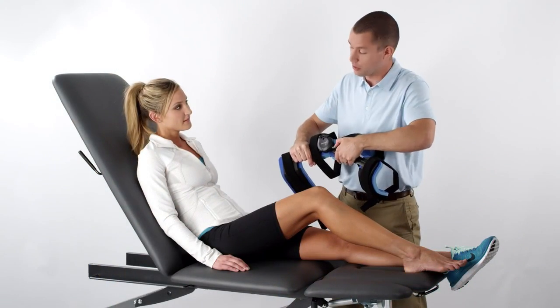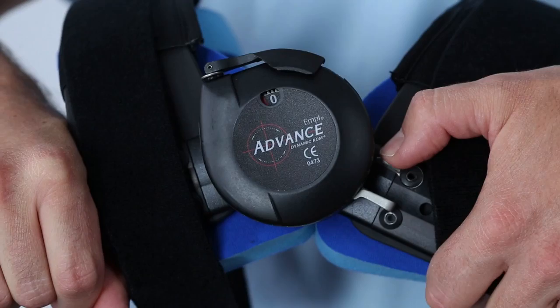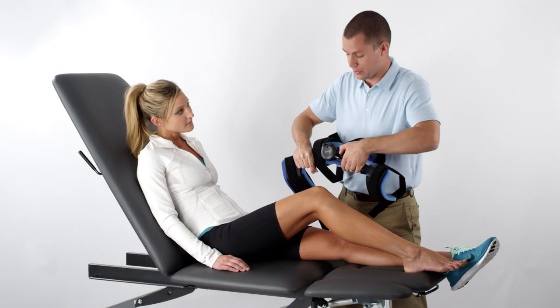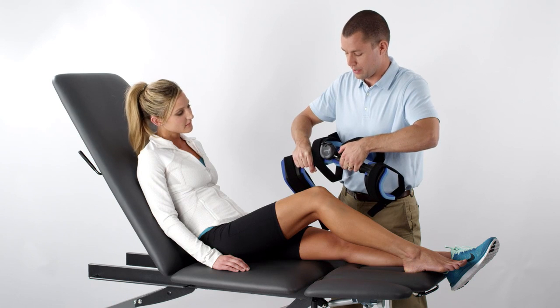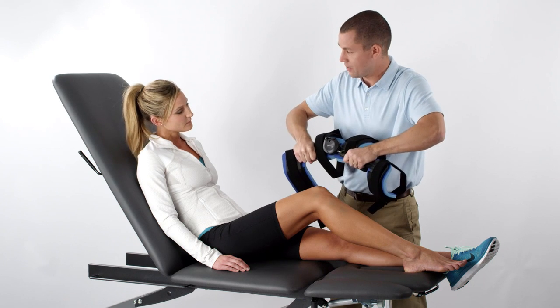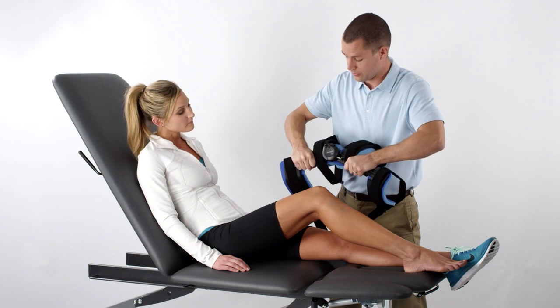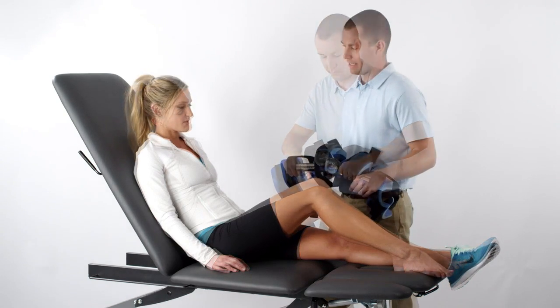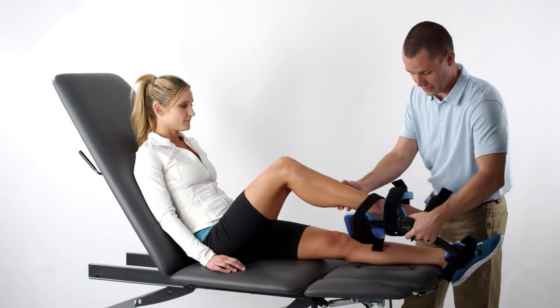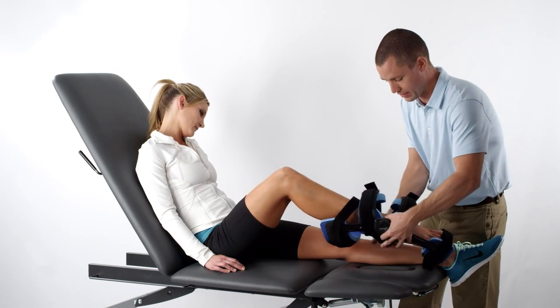To secure the lock, depress the lock lever while you place a slight amount of force on the strut until the lever rotates and locks down into the desired angle. Then rotate the lock lever safety until it engages beneath the lock lever. With the device locked, you may apply the orthosis to the patient's knee.